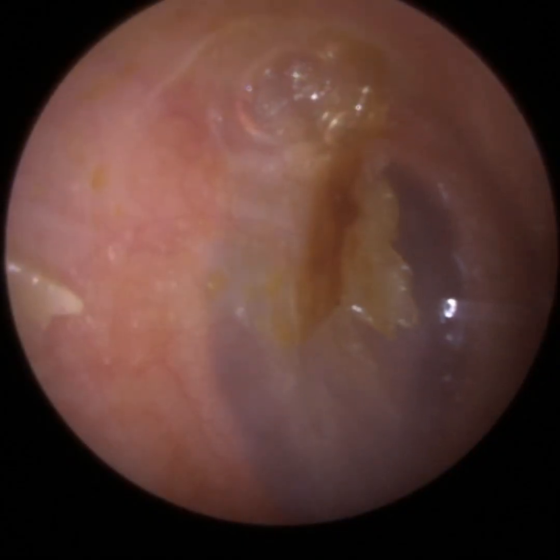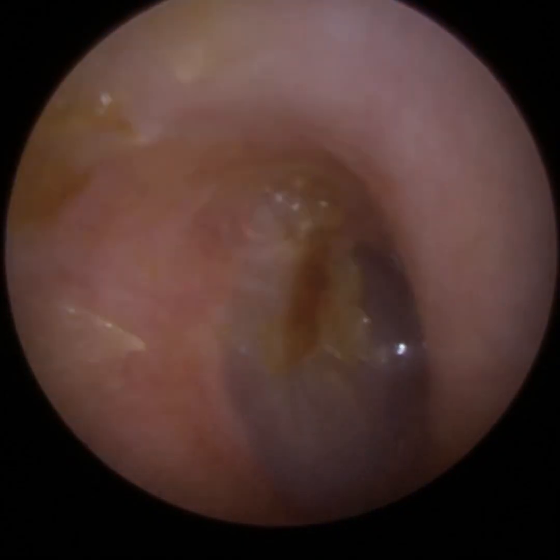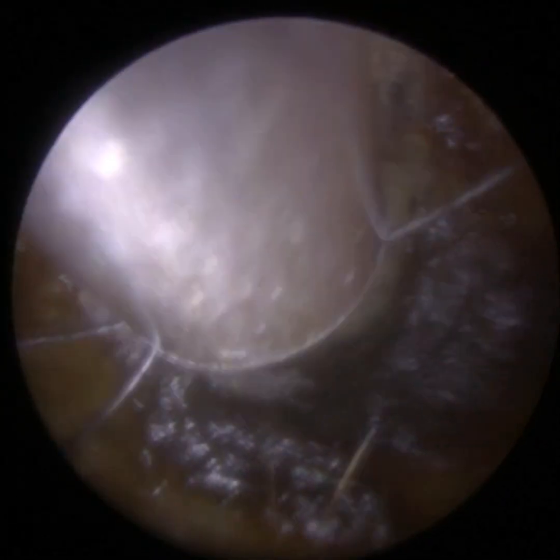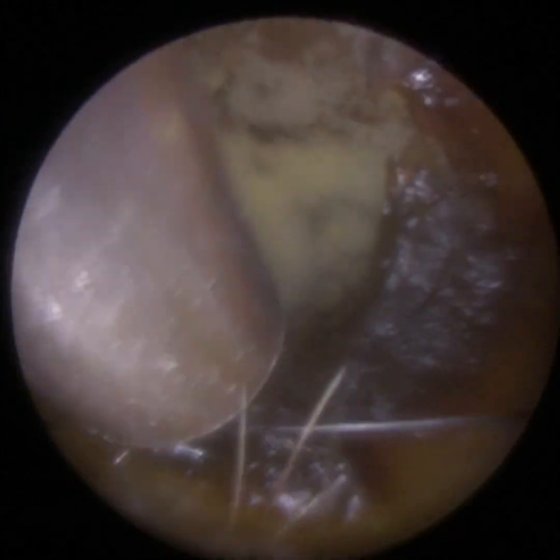So that's the patient's right ear, so it's a lot more visible. There is a bit of skin in the middle there. There is a bit at the top in the attic as well. Now, there's no retraction there. I did check for that. So a bit of sodium bicarb will soften that, and that's part of the treatment plan.